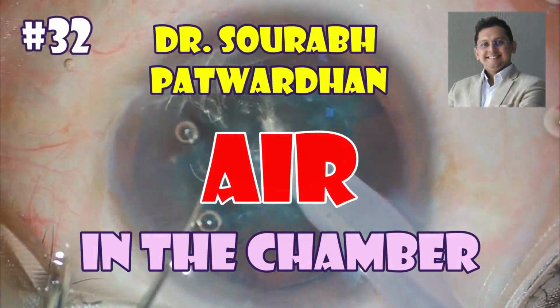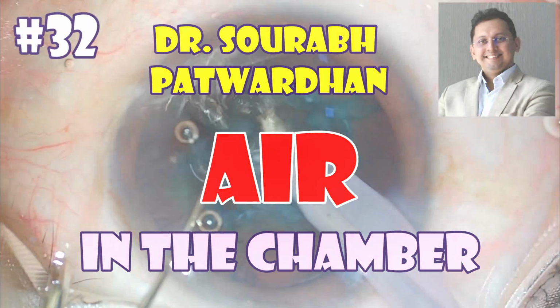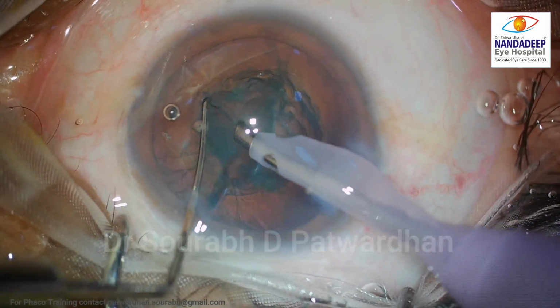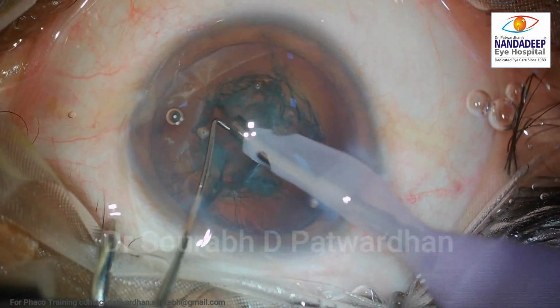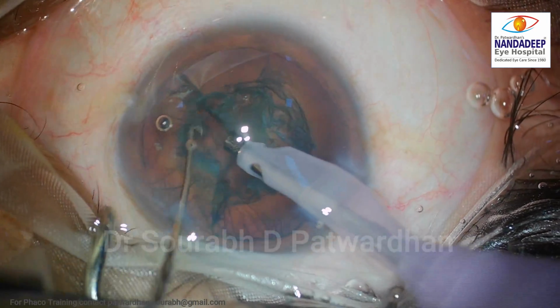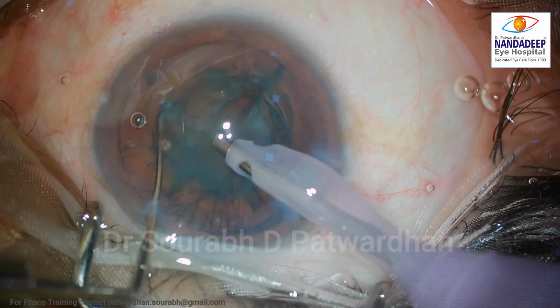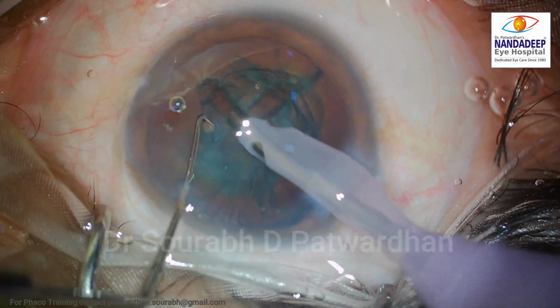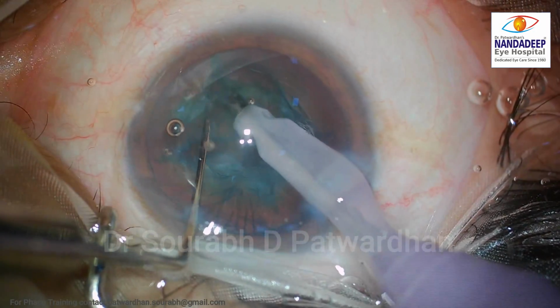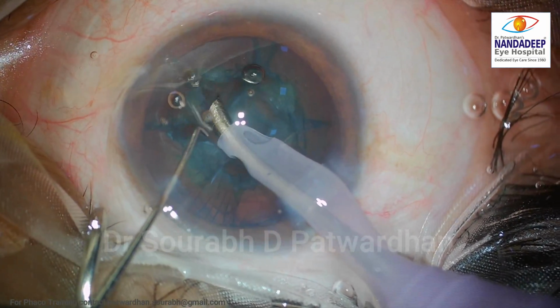And in this video, I'll be speaking about air in the chamber. So it's a regular case, soft grade cataract. I'm doing trench and divide, trying to divide the nucleus into 4 pieces, and then the plan is to remove these quadrants. As I start going from the trench divide to the quadrant removal, as I increase the vacuum of the machine to aspirate these pieces, what I found is that the air started coming in the anterior chamber.